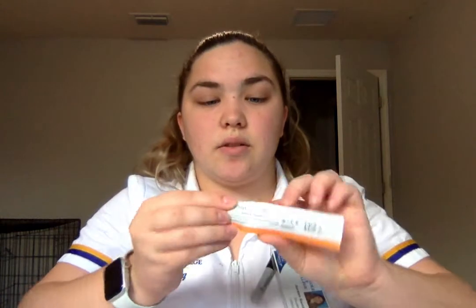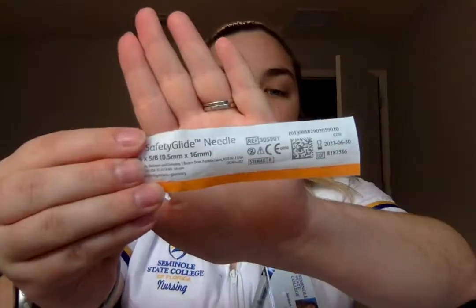And I'm also going to be using a 1 ml syringe. Usually I would because it's less than 1 ml. But I don't have a 1 ml syringe, so I'm going to be using a 3 ml. And then for the subcutaneous, I'm going to be using the 25 gauge and 5/8 inch needle. And then for that one, I'm going to be using the only 1 ml syringe that I have. So those are my needles and my syringes that I've decided to use.